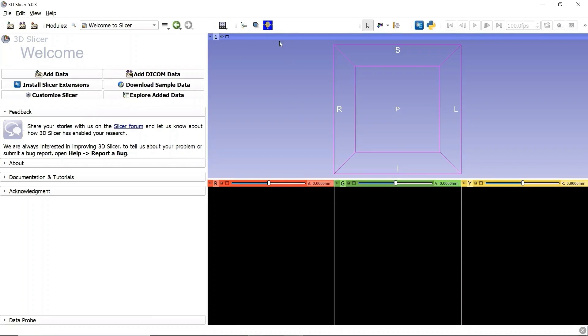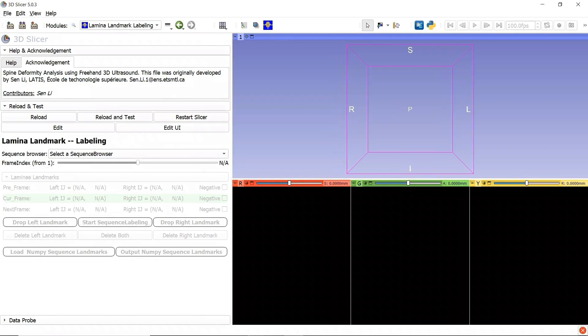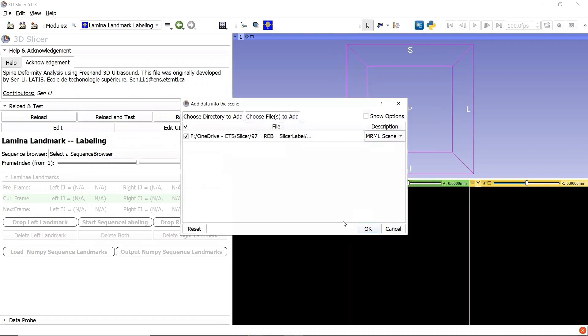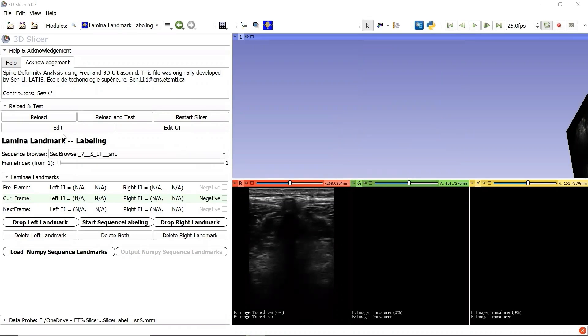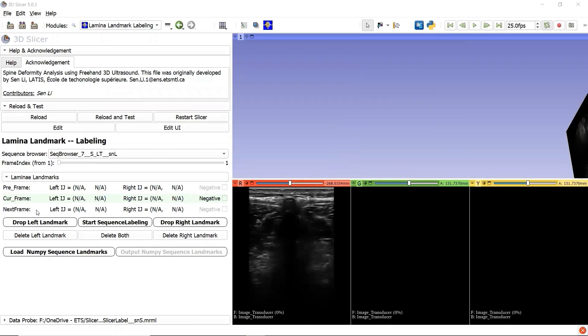We can now go to the module Lamina Landmark Labeling from the shortcut button in the favorite modules. Let's load the sequence file into 3D Slicer. The panel Lamina Landmarks is enabled once we load the sequence file.